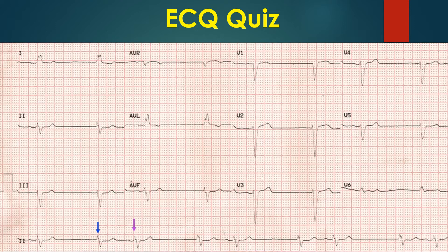The rhythm strip shows sinus bradycardia with junctional escape beats, marked by blue arrows, without preceding P-waves. They have the same QRS morphology as the succeeding sinus beat, marked by a violet arrow. The sequence of junctional escape followed by a sinus capture beat continues throughout the rhythm strip.